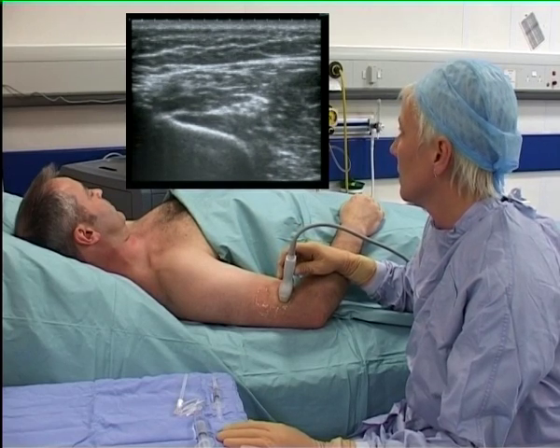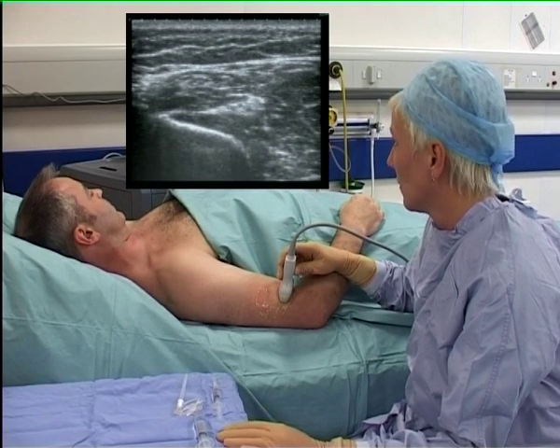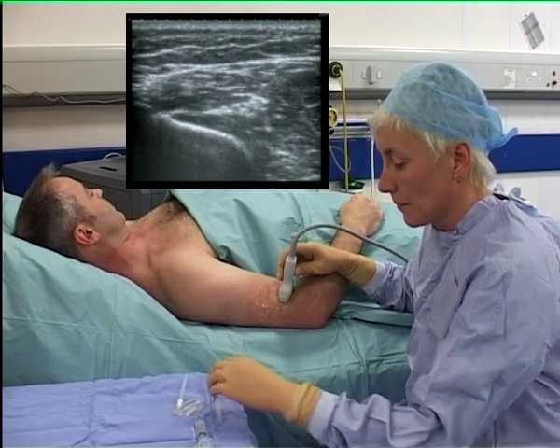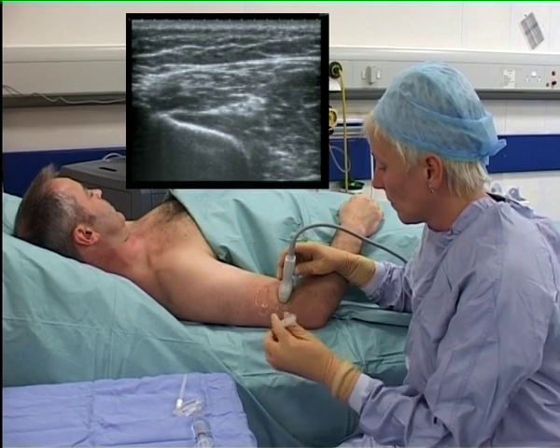The nerve is placed in the middle of the image and small probe angle adjustments are made to improve the image quality.